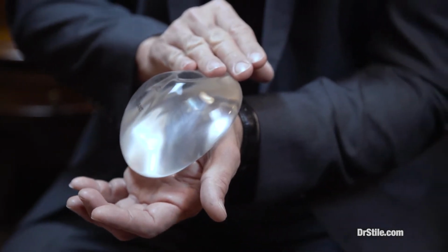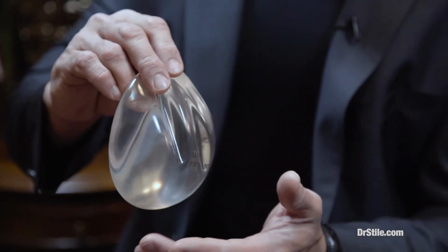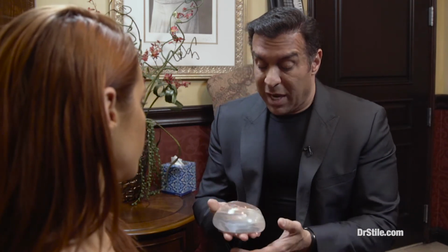There's a recent study where they polled plastic surgeons and had them look at patients who weren't their own to see if they could tell the difference between an anatomic, tear-shaped implant and a round implant, and they couldn't. I've been saying this for many years. Patients always ask me, do you do teardrop implants? And I tell them no. If you look at a gel implant sitting in your breast pocket while you're standing upright, gravity makes it into an anatomic or tear shape. The good thing about a round implant is that no matter what position it's in, because implants do move with activity, it'll always be round. With an anatomic implant, sometimes your breast can look a little distorted if it's not sitting appropriately, and we'd like to avoid that. Because of that, I always use round implants.